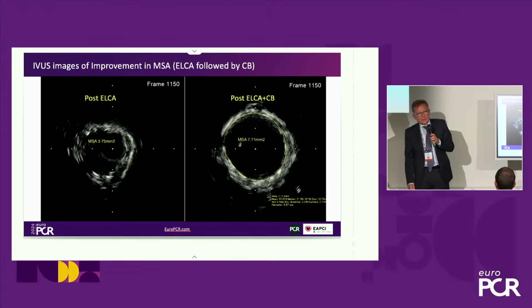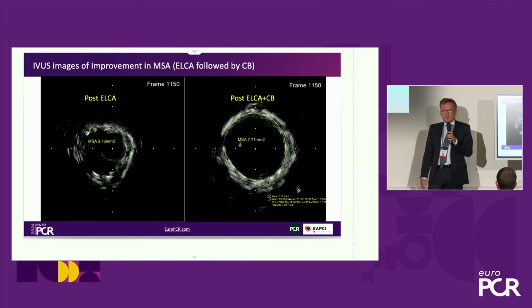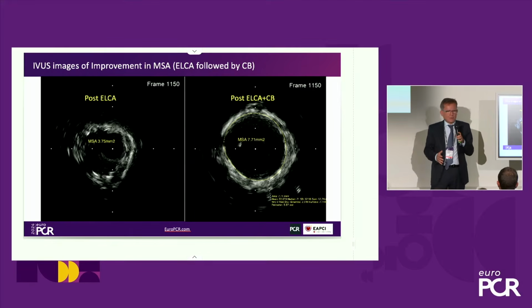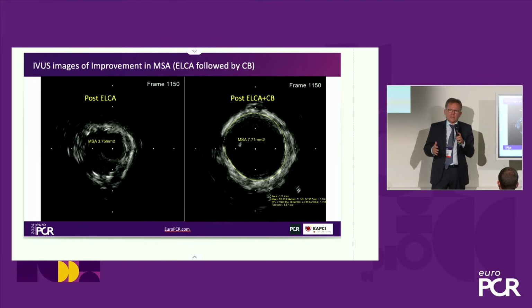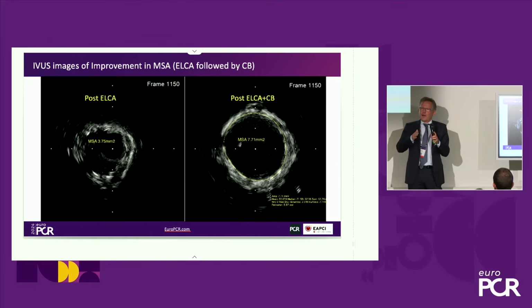And now I can tell you that according to the new data from the last 5-6 years, the level of dissections and perforations during PCI and ELCA is the same. It's not a reason to be afraid. Of course, a lot of people just remember that 15 years ago it was different. Yes, it was different because they used a lot of laser in cases that were not suitable and did not follow the rules. It was the same as with BRS. They were excellent tools, but used not for the cases they were produced for.